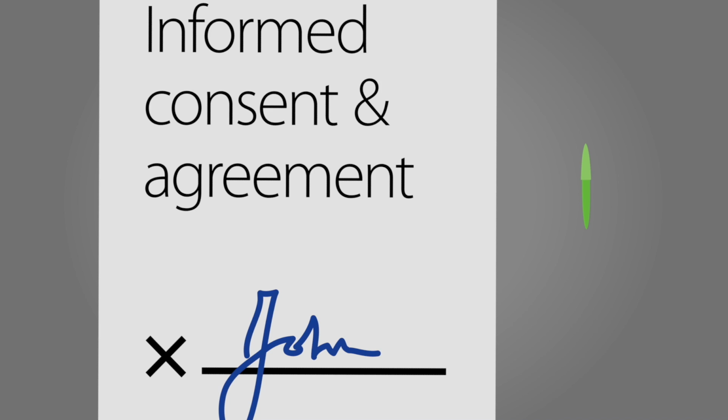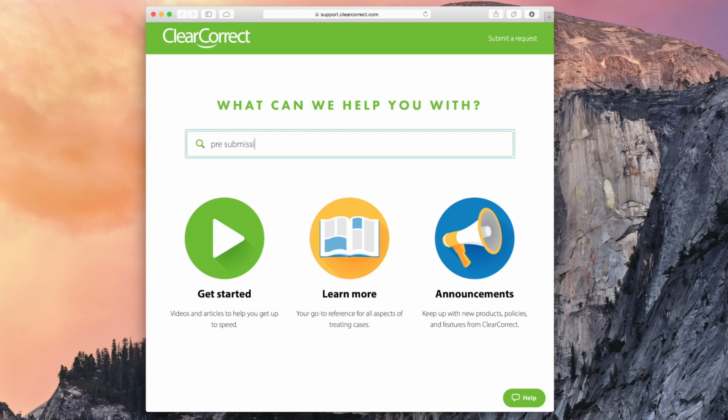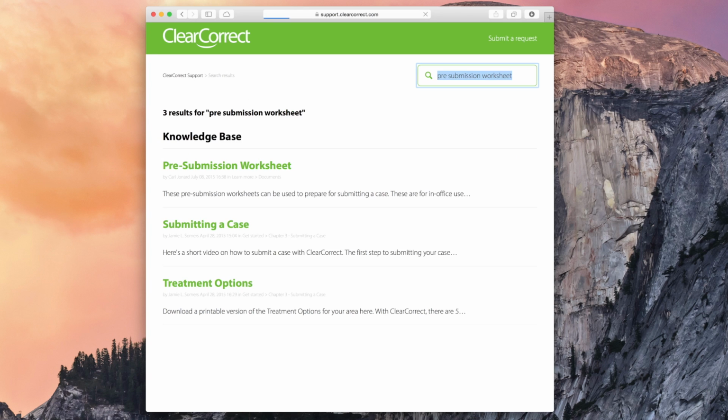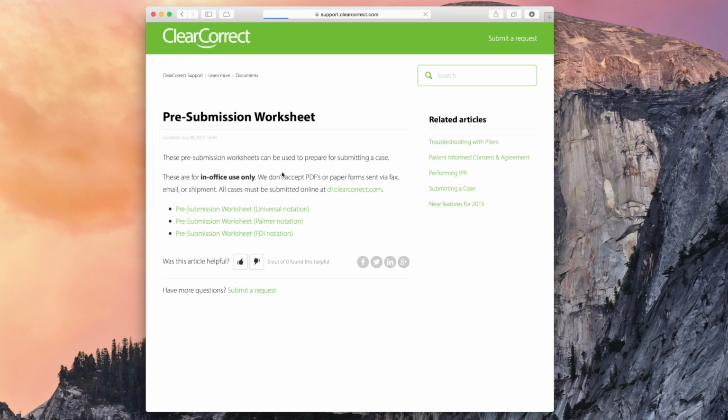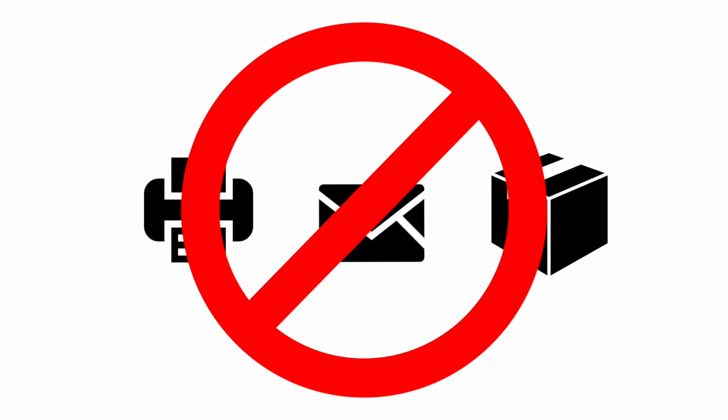You can download this form from our Help Center at support.clearcorrect.com. If you prefer to pre-fill a submission form by hand, you can find a pre-submission worksheet on the Help Center as well. These are for in-office use only. We won't accept PDFs or paper forms sent via fax, email, or shipment. All cases must be submitted online.